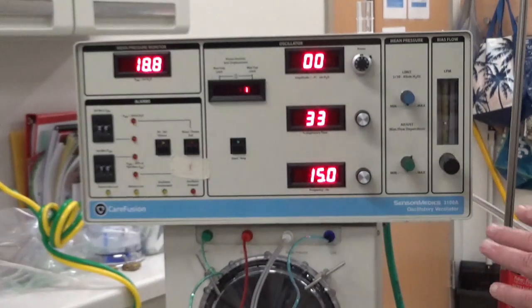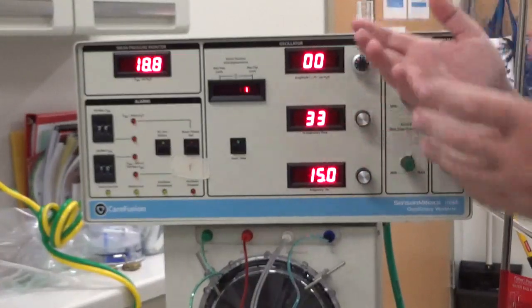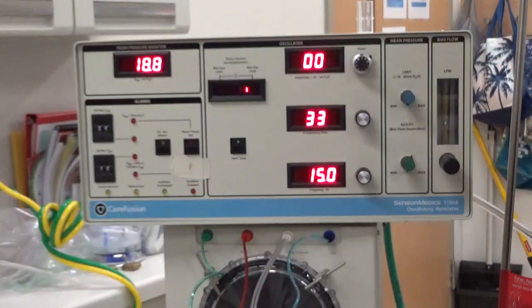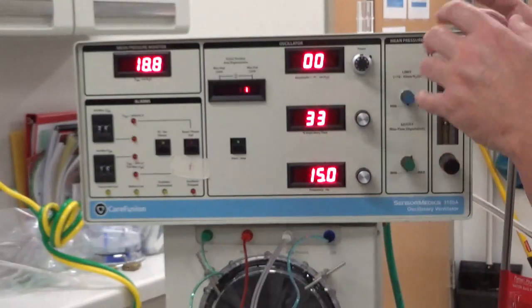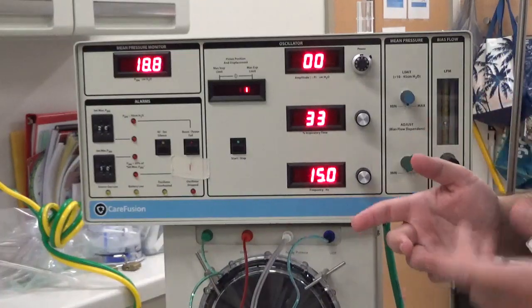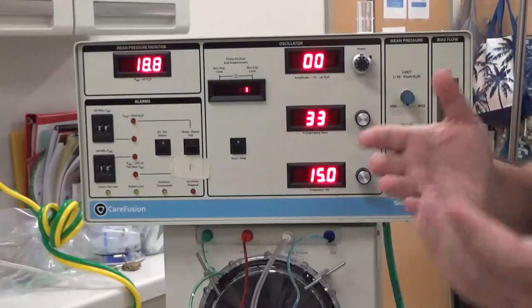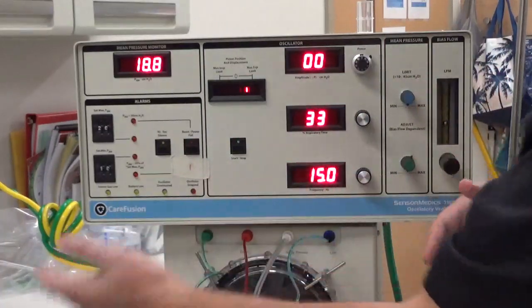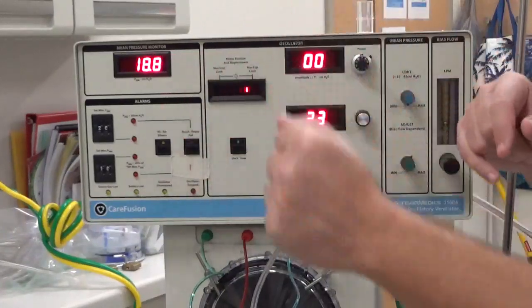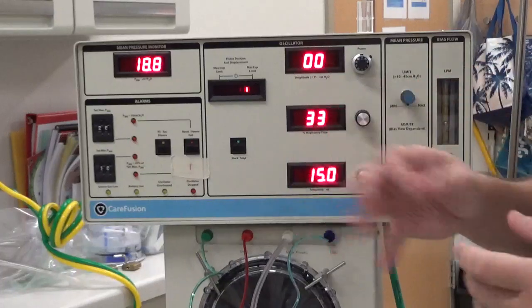Alright, so now I'm going to talk about settings and how the ventilator reacts to what you do to it and how the patient reacts. So basically, when you are making changes on this ventilator, you want to think of it kind of like a pressure ventilator. Our mean airway pressure would be similar to our PEEP. FiO2 on our blender, same thing. So oxygenation wise, mean airway pressure and FiO2 are your main drivers of PaO2, or oxygenation.